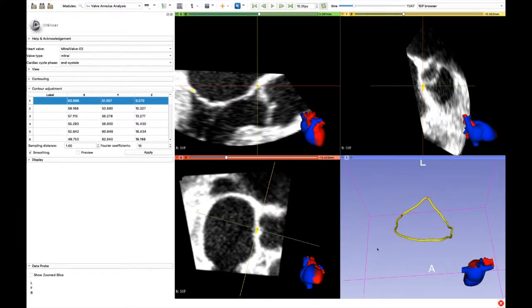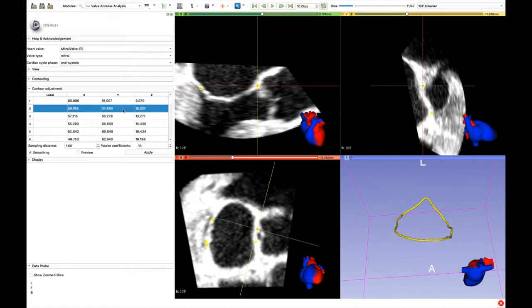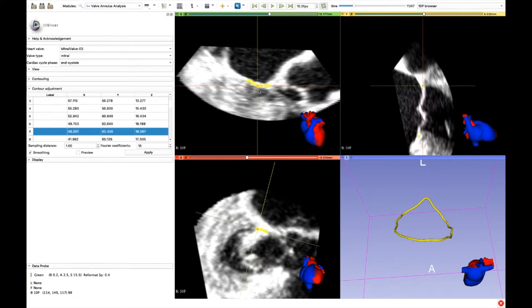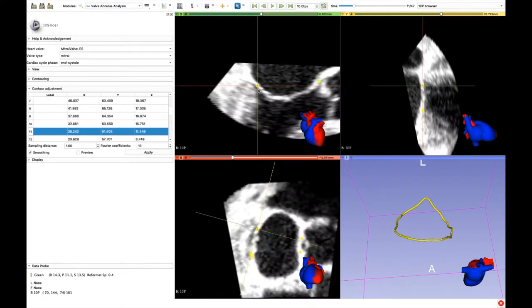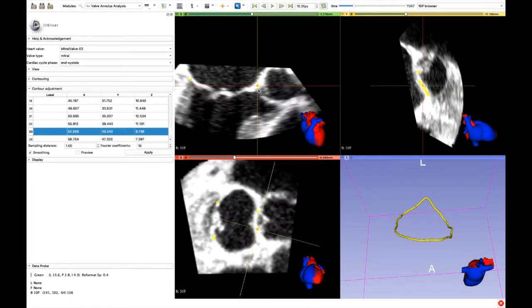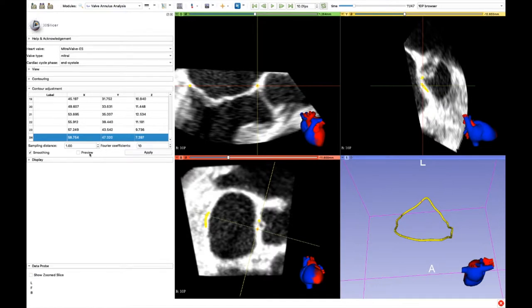It is always wise to check the placement before proceeding. If needed, every point can be overwritten. We can see a preview of the annulus and then proceed by clicking on the Apply button.